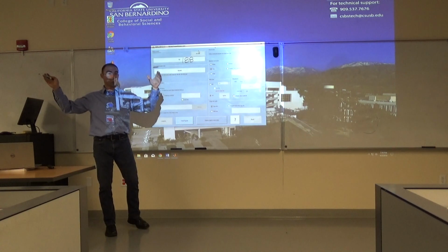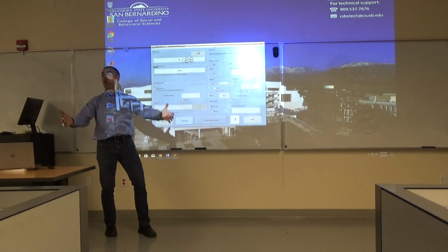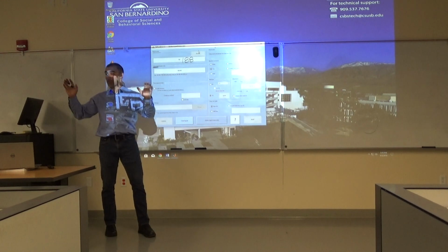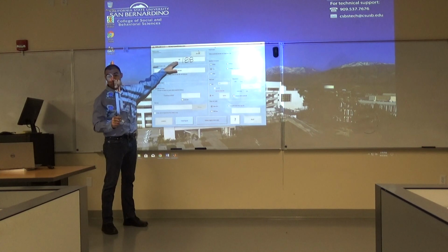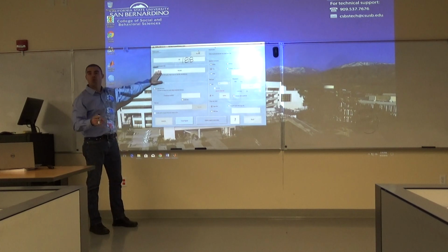So now you're like the demanding king or queen, and you're like, I want to see brain data now. And the servants are like, oh, okay, just what kind do you want? They want to know what brain data condition do you want to see in the experiment. So here's where we put the number of what condition. We'll get to this all later, right? Here they're saying, well, during what time? What time do you want to see it?